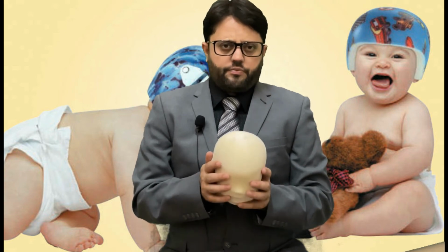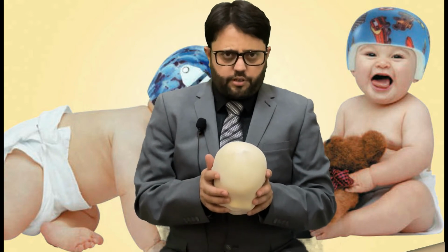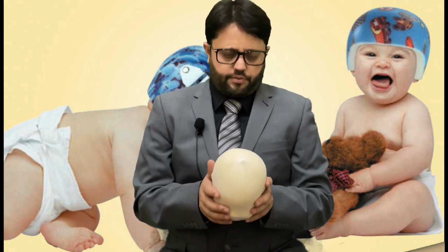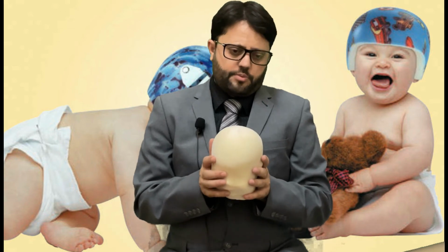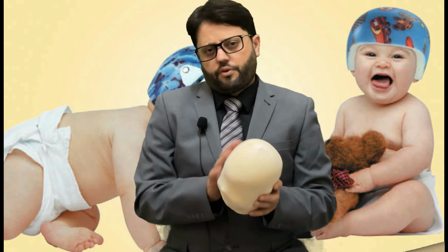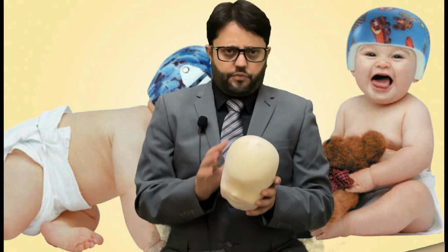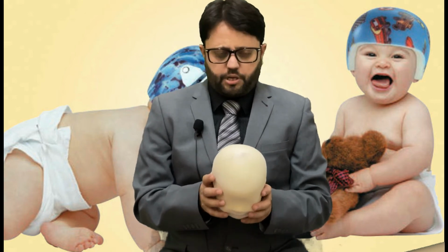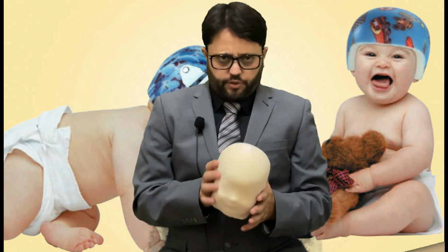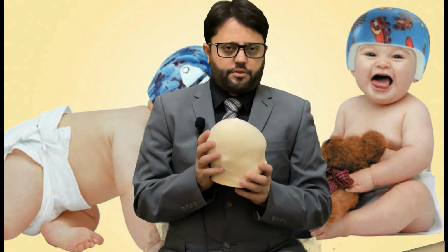First of all, when the patient comes to us, we have to see and diagnose whether this is a positional plagiocephaly, a positional brachycephaly, or a positional scaphocephaly. In those cases, we need to check many things. First of all, the patient should be free from craniosynostosis. That can be diagnosed by MRI by a doctor. If you are not clear about that, it is much better to refer the patient back to the treating physician, so he will do an MRI and confirm that this is not a case of craniosynostosis.